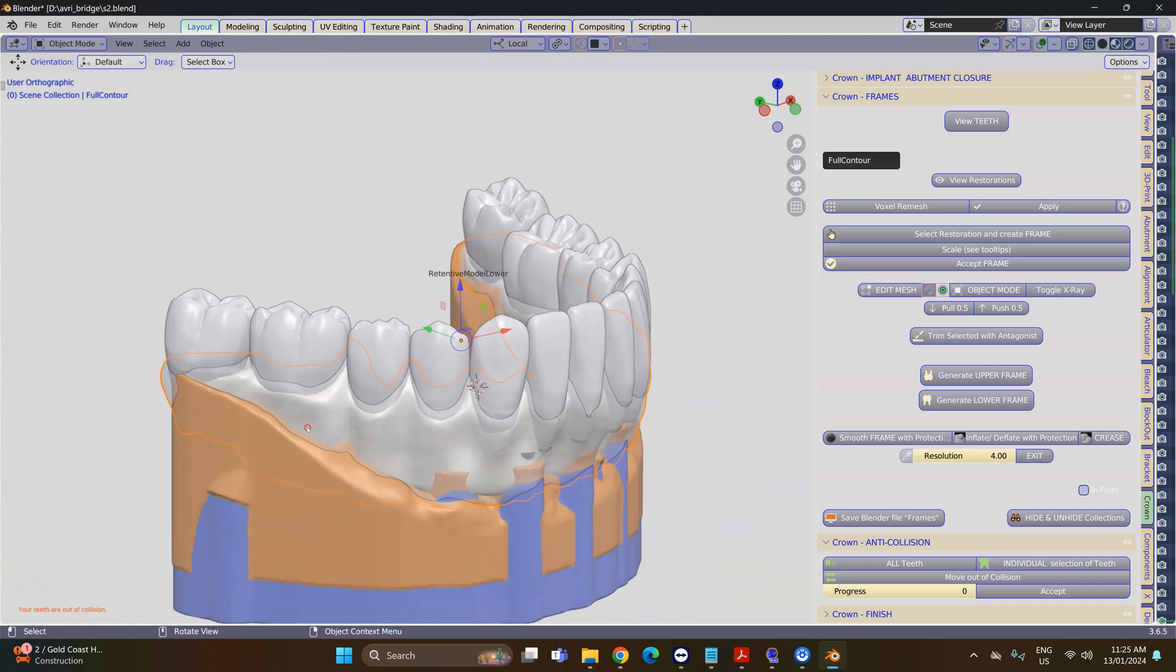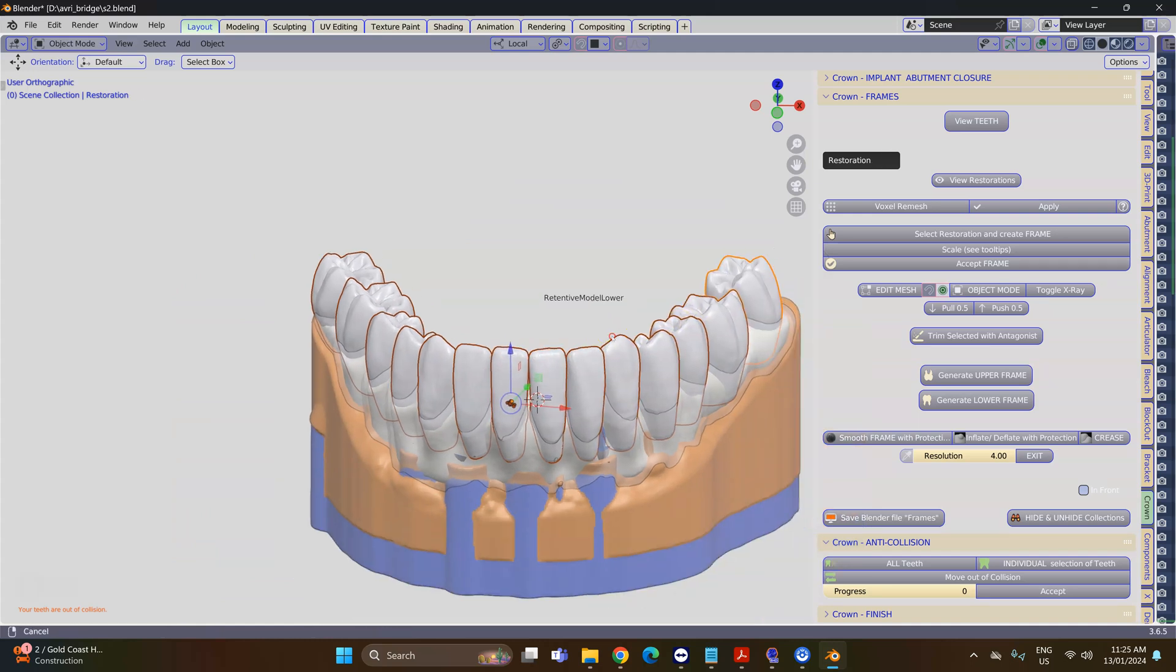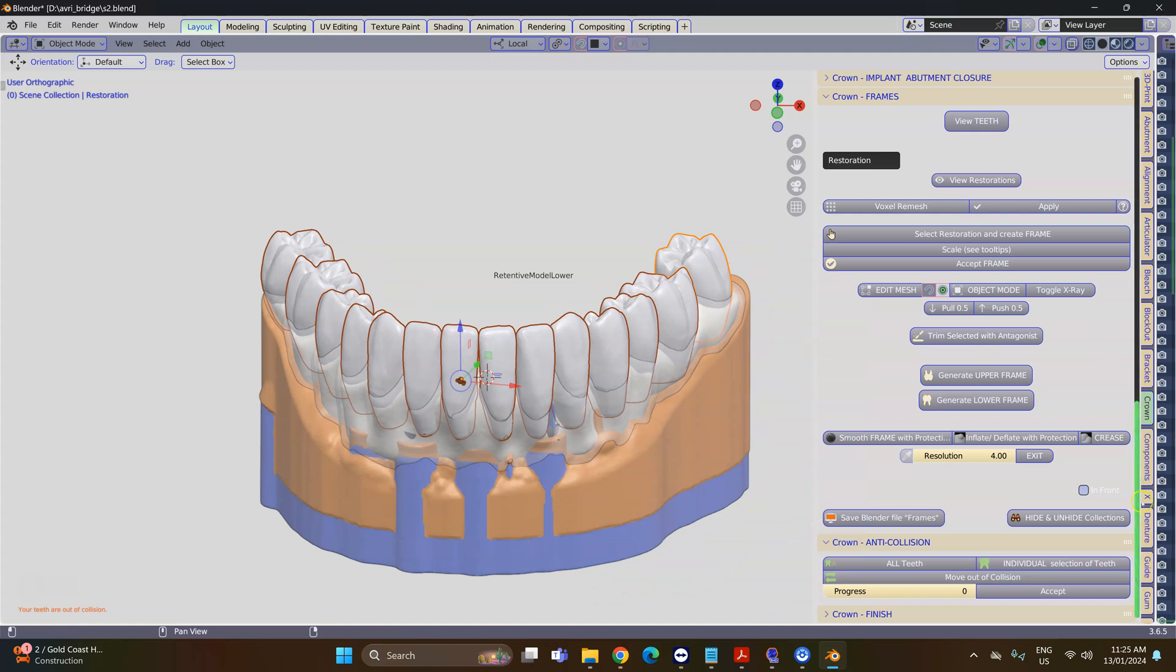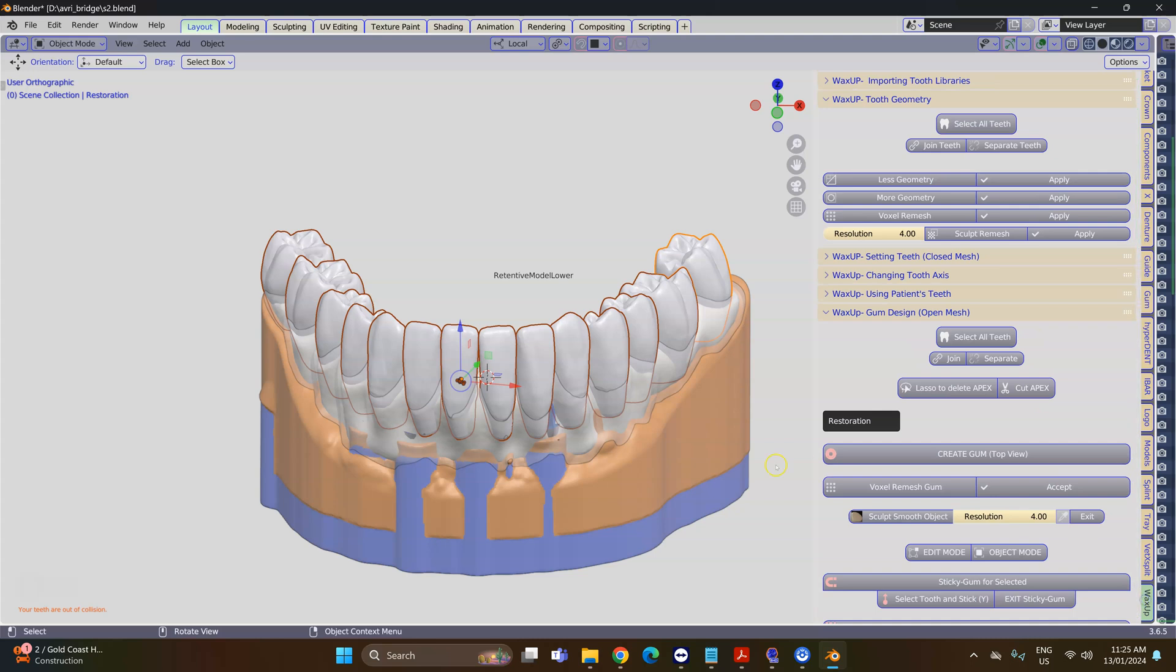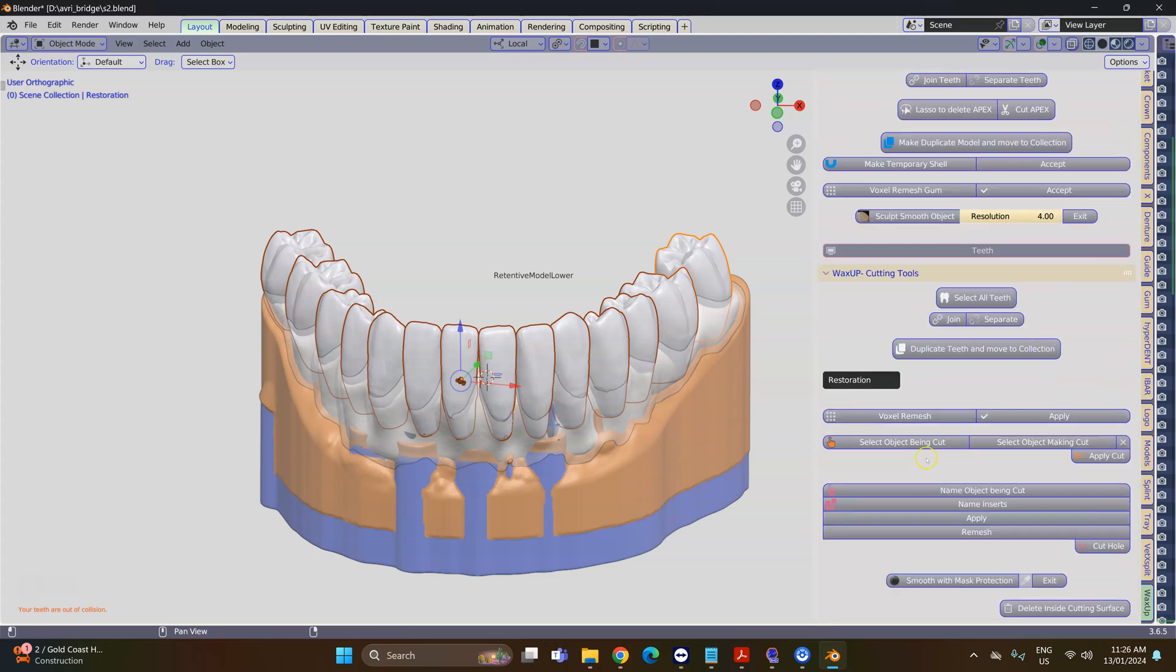Then I'm going to select all of these teeth individually—don't select anything else—and then we're going to go to the menu in the Wax-up module. This is very important because the Wax-up module will cut in a way that we can delete the actual cut surface. So Wax-up module.